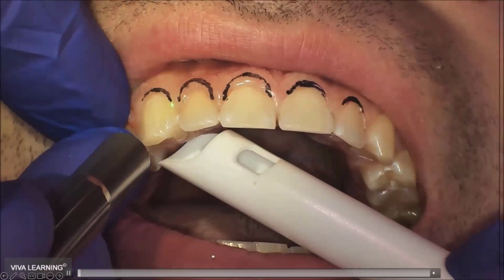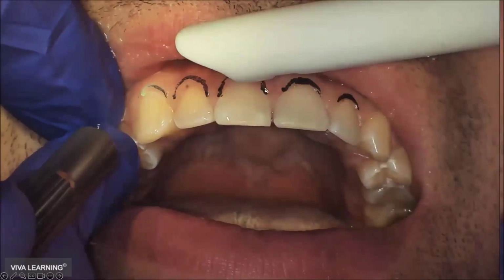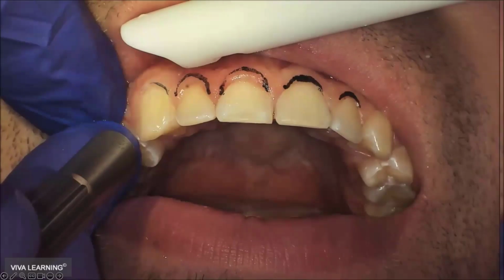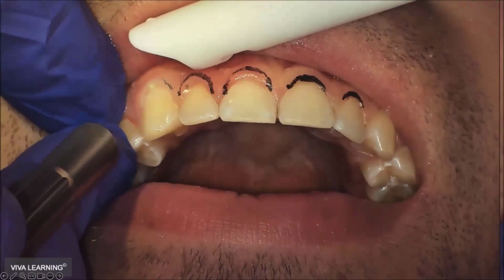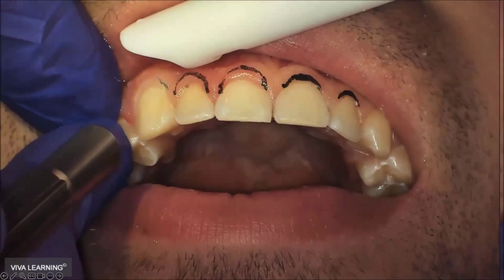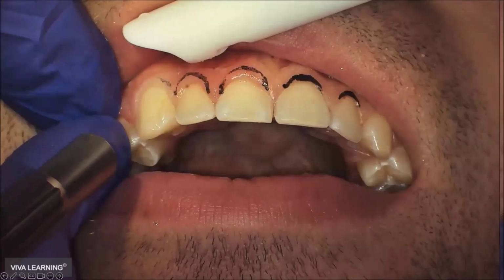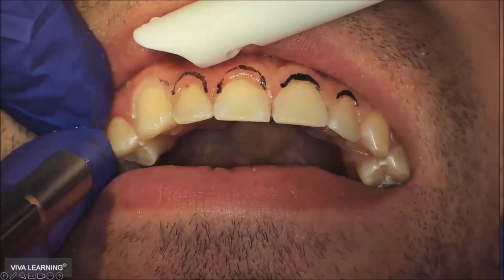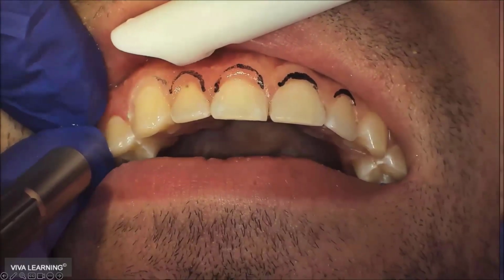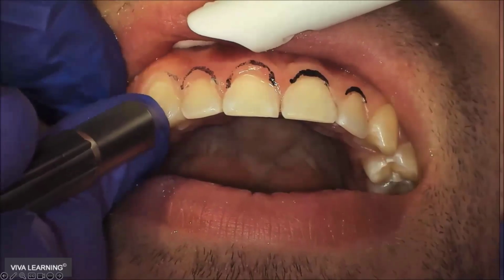But here's a case where basically I'm just doing an aesthetic gingivectomy, and just sculpting that. I have it on a nice low power, and it's more than just cutting. Someone asked the question of how do you not hit the tooth? Look, we just talked about this a minute or two ago, where you can actually see the sculpture of that gum tissue, but I'm not hitting the tooth at all.